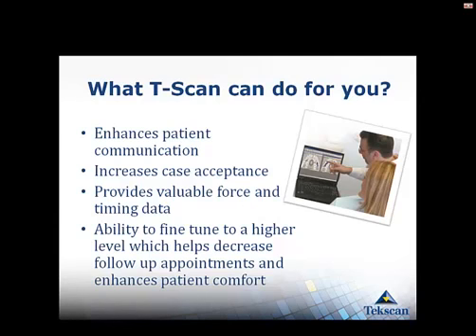It's also going to provide you with valuable force and timing data in other parts of your practice as well. And the fourth thing that's listed here is the ability to fine-tune to a higher level. Take, for example, splint therapy. If you do a splint on a patient and you are able to fine-tune it to a higher level with TScan, the patient's going to be more comfortable faster, and you're going to be able to decrease the amount of follow-up appointments that you have normally scheduled for that patient.